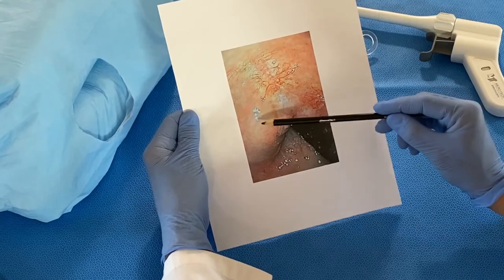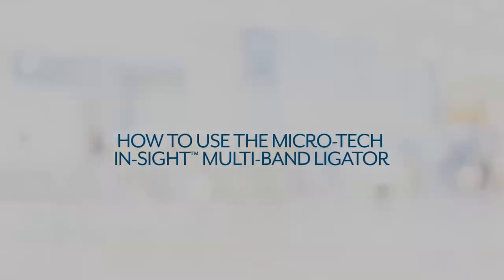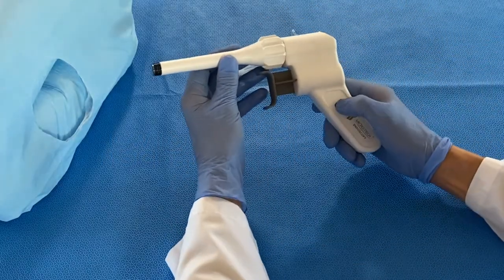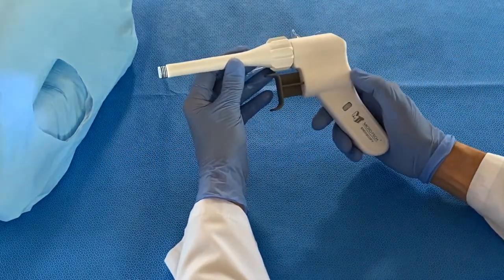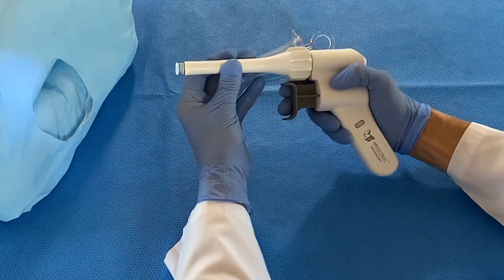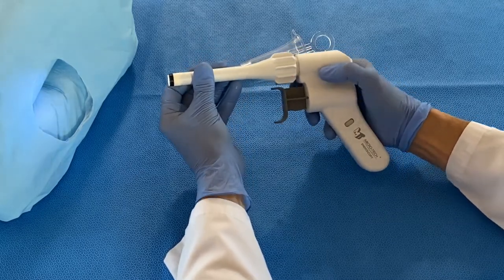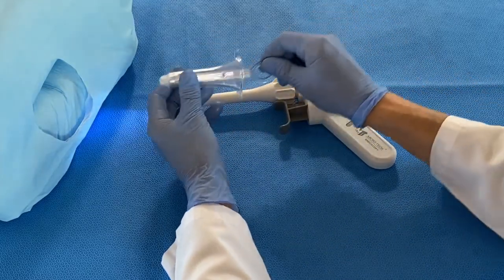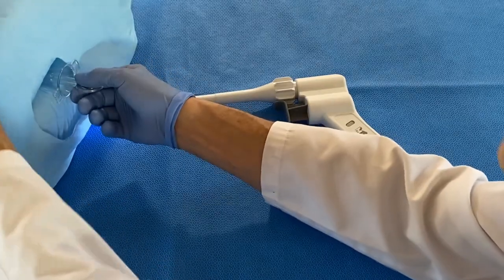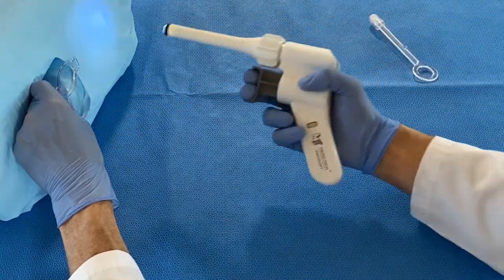If additional banding is needed, placement of the band will be here. This is how to use the new Insight Ligator: switch the light on, check the suction by pulling and releasing the trigger, move the bands to the front of the suction chamber.